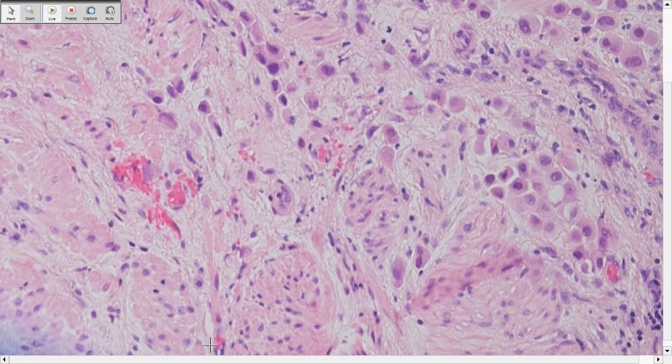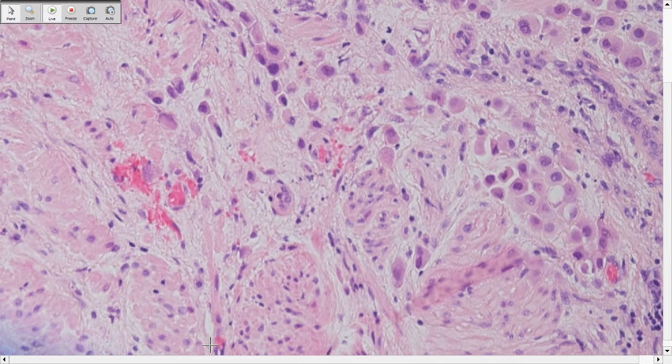So if we compare exactly like this. When you say plasmacytoid, whatever you say, don't forget to do a breast marker. 50% you may find is metastasis. Same thing in the stomach: if you see signet ring, don't forget to do a breast marker. They have 50% maybe metastatic from breast to the stomach. That is true. Signet ring is not only seen in the stomach.